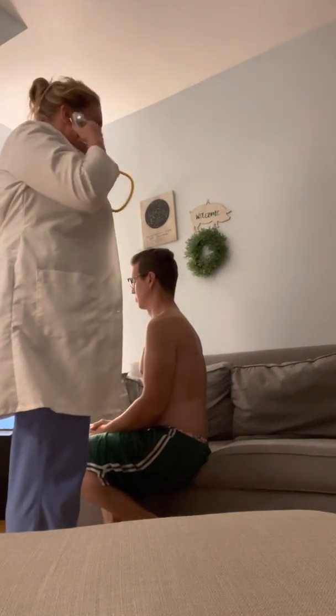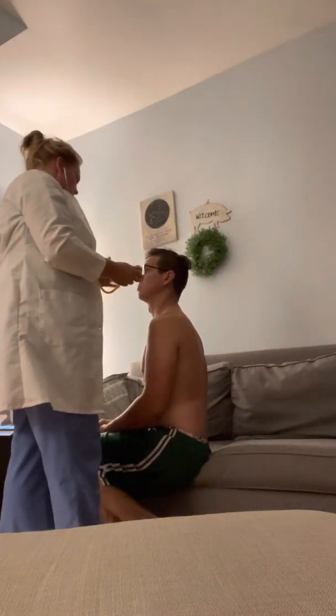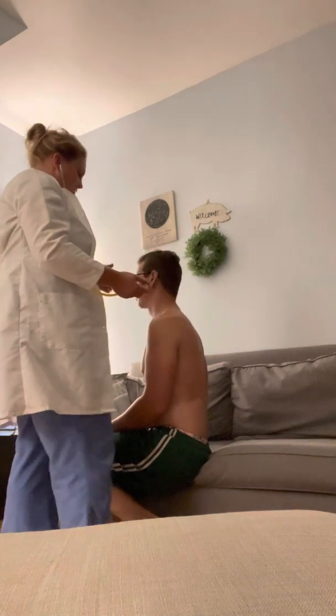So we're using the diaphragm of our stethoscope for this. And so when you feel the diaphragm of my stethoscope hit your back, if you could take a nice deep breath for me, okay?